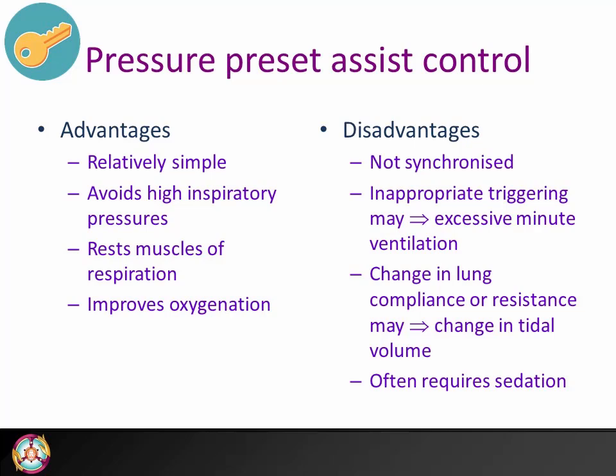The disadvantages are that it is not synchronized with the patient's breathing, so a ventilator-initiated breath may come on top of a patient-initiated breath. Again, inappropriate triggering may result in excessive minute ventilation. A change in compliance or resistance results in a change in tidal volume, and it also often requires sedation to achieve patient-ventilator synchrony.